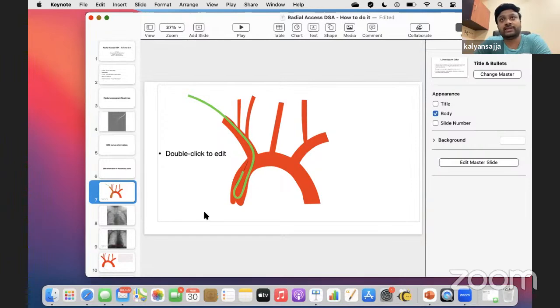But in my practice here, I do have some radial artery occlusions. There won't be any symptoms clinically. Many times I was actually doing the left radial. It's good that you're doing some left radials. Left radial is a good way, especially for follow-up angiograms. It's the non-dominant hand, and even in the initial angiogram, you can do left radials.